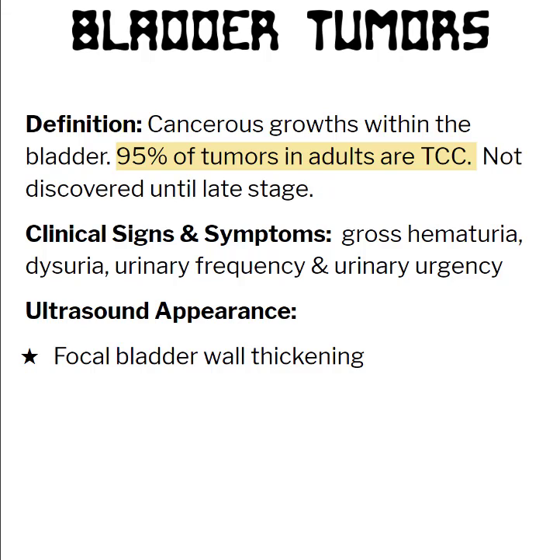They came in for some sort of GYN exam, and because their bladder is full and it's in the pictures, we incidentally found cancer that way. So always take a look through the bladder if you're down there. It doesn't hurt just to take a quick look through. You might actually save somebody's life or get them treatment a little bit sooner.